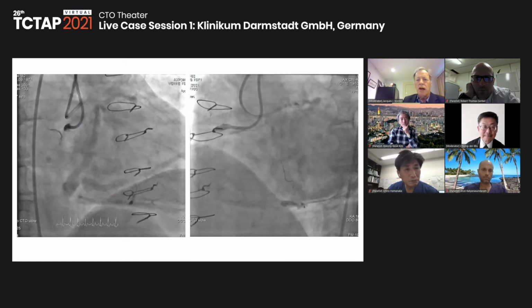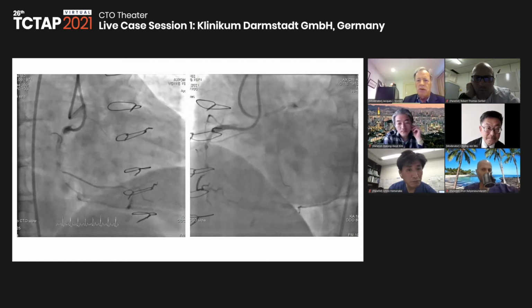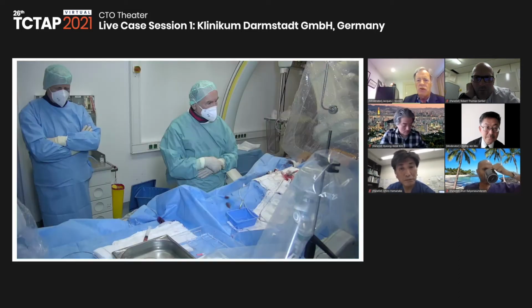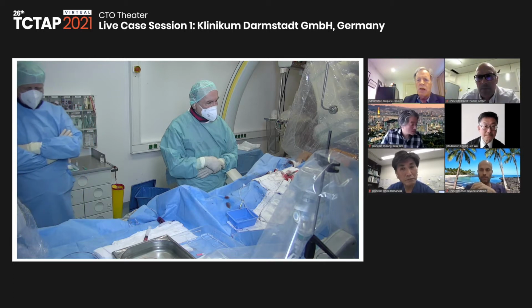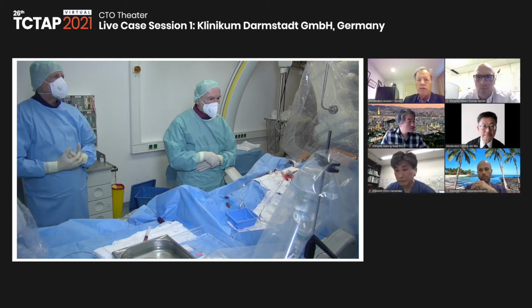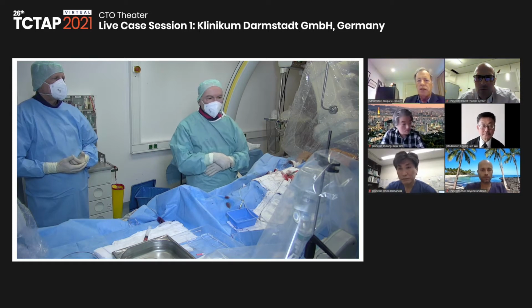Just before you start, Gerald, a more general question. In light of the EuroCTO study, ischemia, etc., what's the functional class, and how much does that guide you in performing a procedure? I saw you made a MIBI SPECT to have an idea about the amount of ischemia. It's a large defect. Is it routine for you to do a MIBI SPECT before starting a CTO procedure?